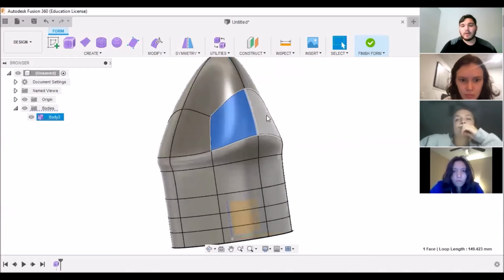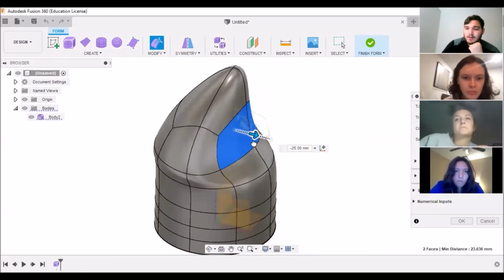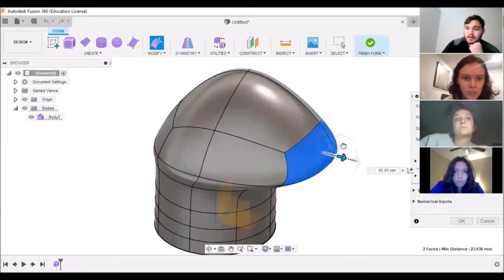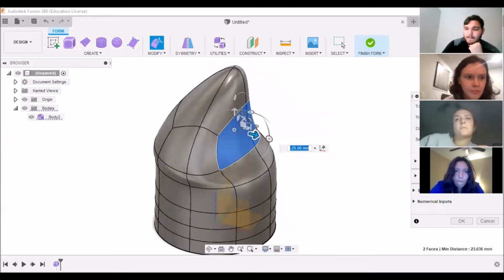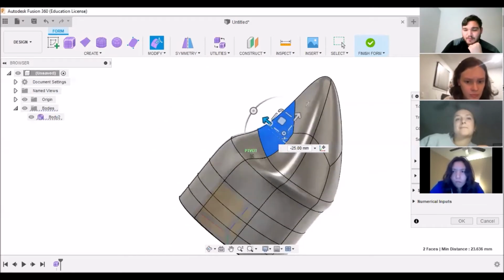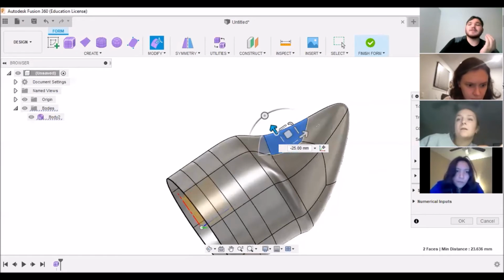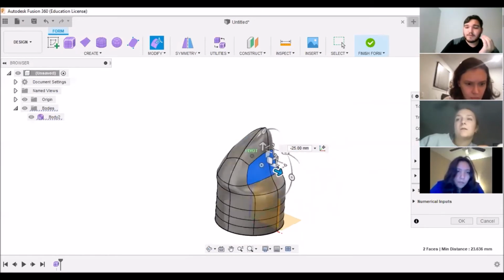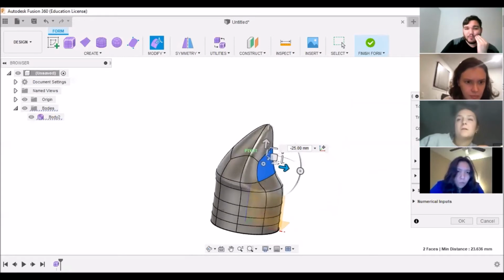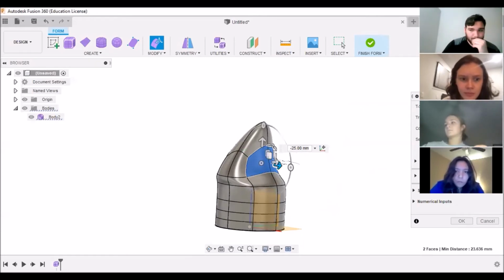Okay. You can also modify faces. So if you want to modify those two faces, you Control-select them, and then you can pull it in, bring it out. I don't know whose thumb this is, but I feel bad for him, I'm not gonna lie. But this creates more dynamic forms, something that looks more organic. And so I really appreciate the form tool a lot because you can be less specific with the exact measurements and more realistic and human-like, which I find very valuable.